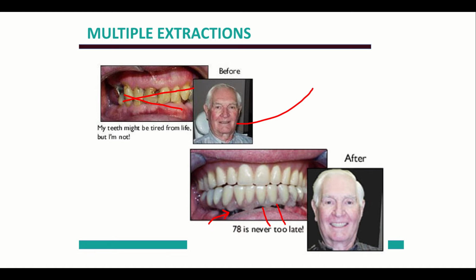where the teeth are missing, and we want them spread out and stable if we're only going to use a few. Or we can go ahead and give them an immediate denture. So this would be something that would be bonded onto these implant anchors, and they can't take this denture in and out. Why would that be an advantage? Well, using those implants helps to stabilize the denture and to prevent bone loss. So those implants are really, really valuable.